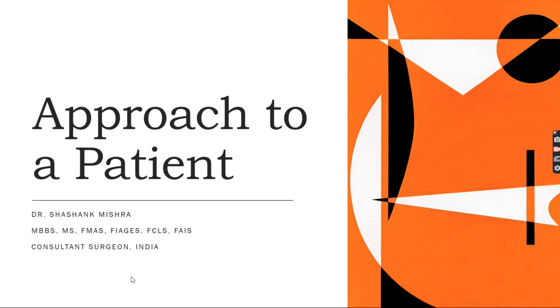Now the purpose of this video is to show you the findings of a diagnostic laparoscopy in a patient who presented to us with abdominal distension with significant weight loss in the last 6 months, and on ultrasound abdomen it is suggestive of presence of ascites with multiple fluid levels.